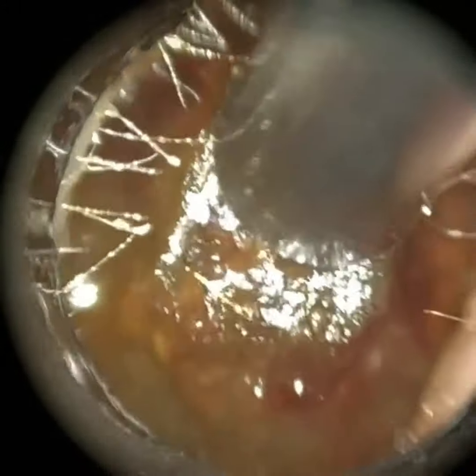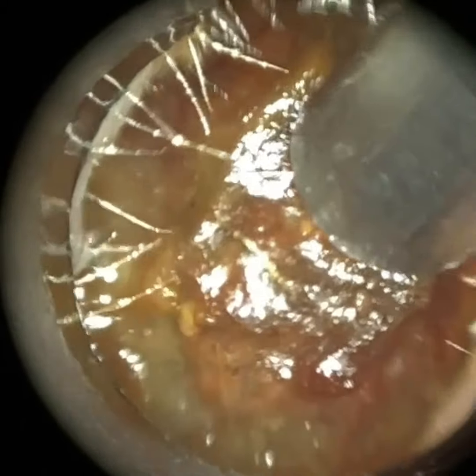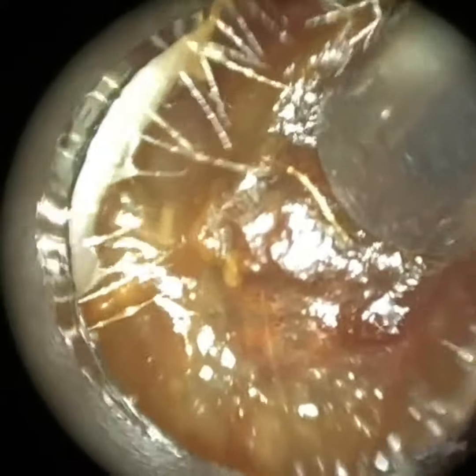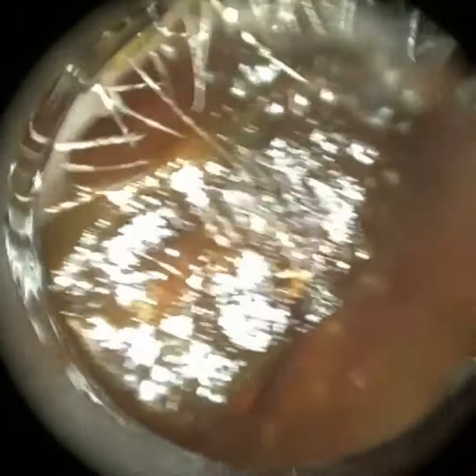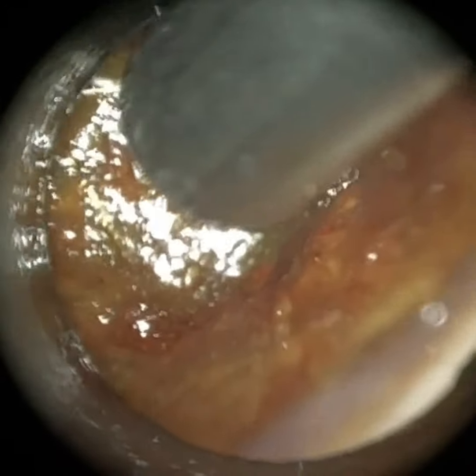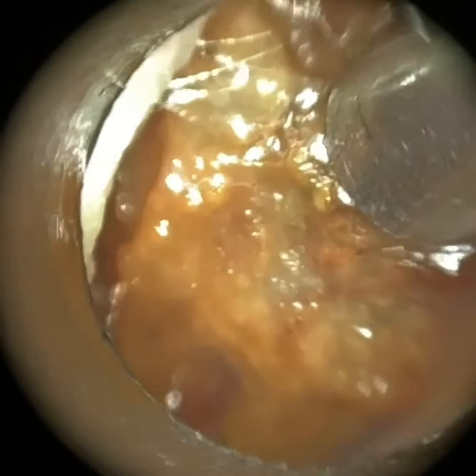The GP, according to the patient's mother, attempted to remove the wax in their left ear — this is the patient's right ear, so you'll see the left ear in a moment — using one of these online USB endoscopes, which has got a tip that is huge in comparison to the tools that we use. They inadvertently pushed the left wax plug deeper in the end.